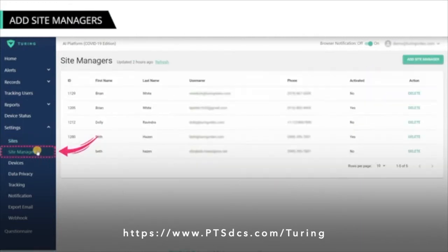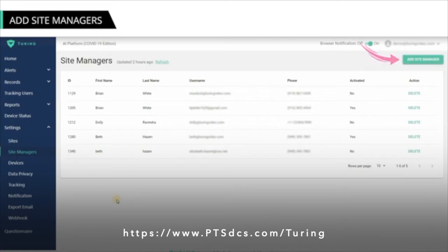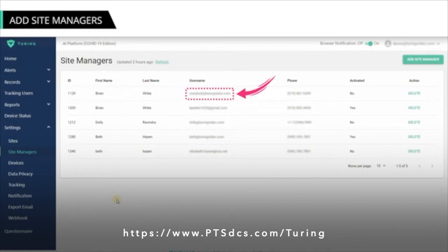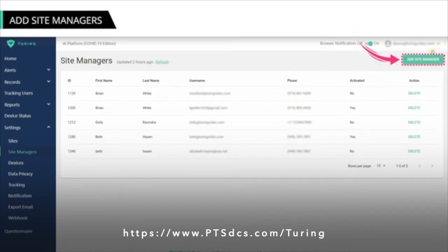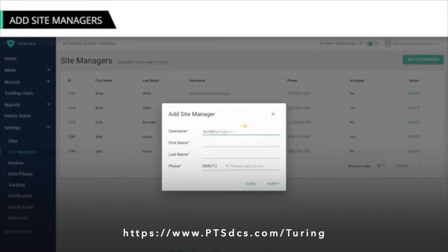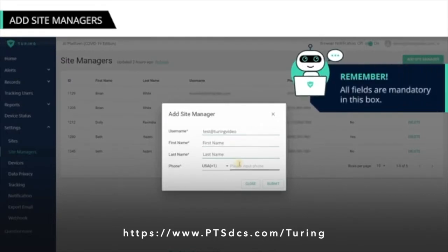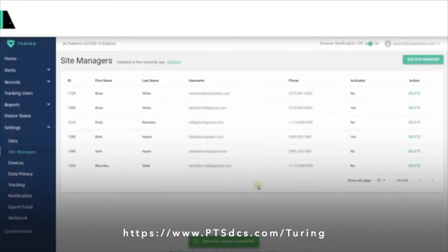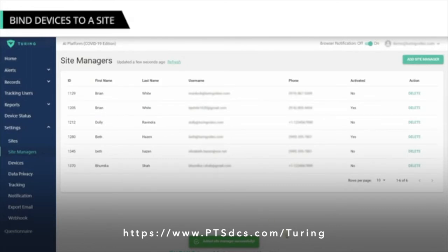From Settings, go to Site Managers to manage individuals who monitor alerts data for a specific site. On the Site Managers page, you can add a new site manager or delete an existing one. You can also view attributes of existing site managers, including their ID, first name, last name, username, phone numbers, and activation status. To add a new site manager, click Add Site Manager. In the Add Site Manager overlay box, enter relevant information in all the fields and click Submit. As a system administrator, you may need to bind devices to a site so one site manager can monitor data for more than one scanner.